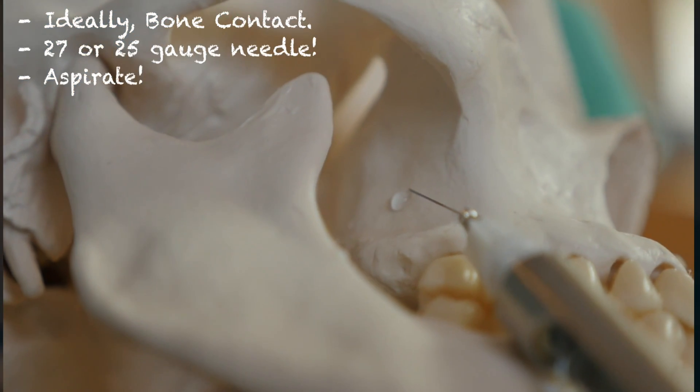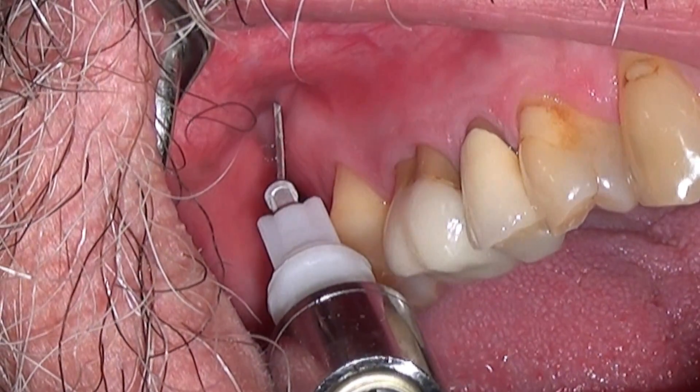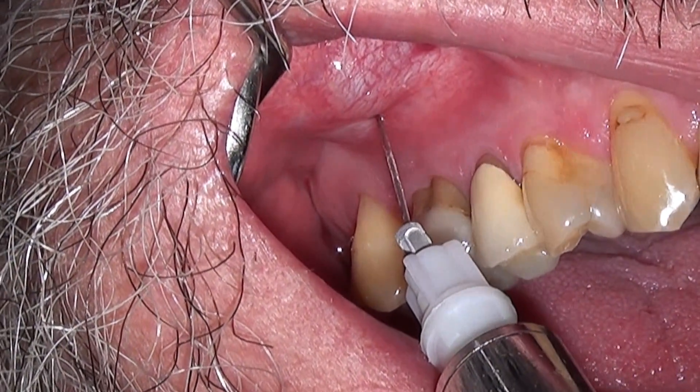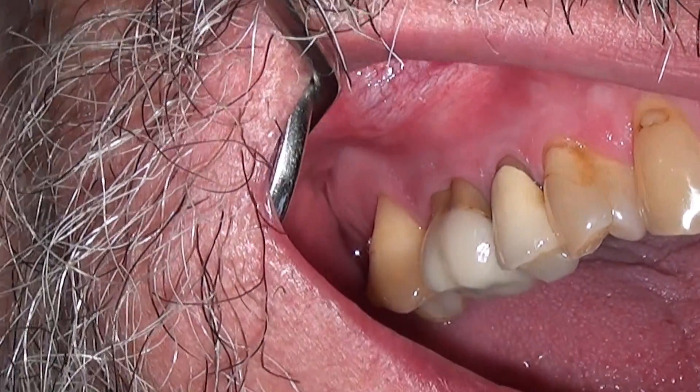Usually, a single cartridge of vasoconstrictor-containing anesthetic is enough for the second and third molars. But for the first molar, an additional buccal infiltration is sometimes needed because the mesiobuccal root is occasionally innervated by the MSA as well as the PSA.